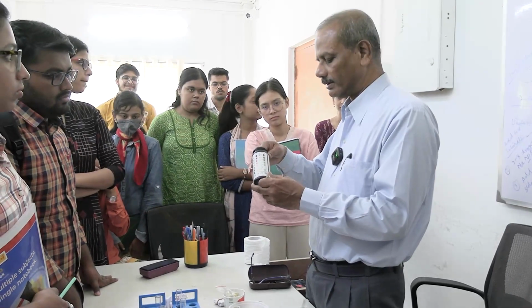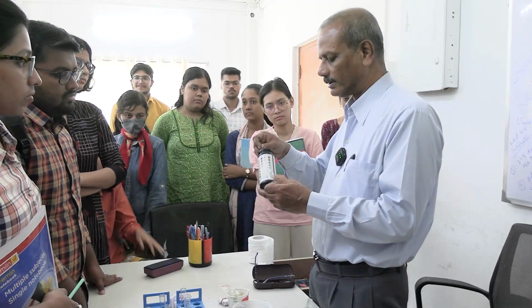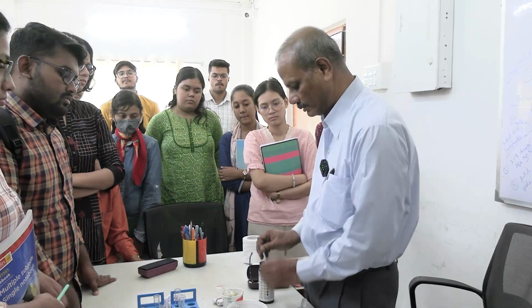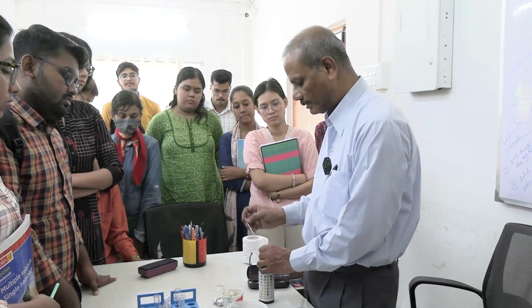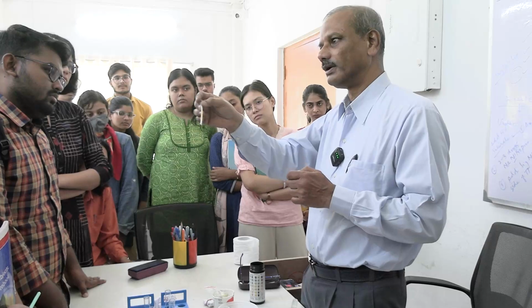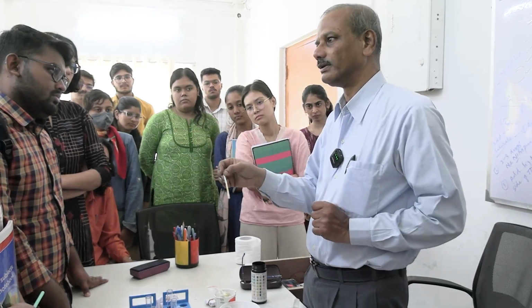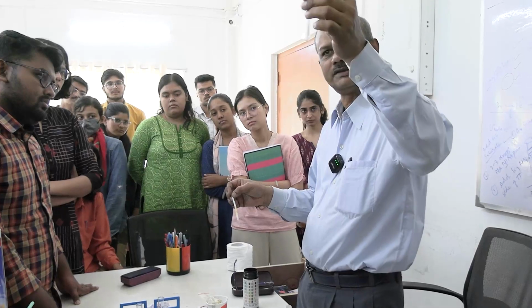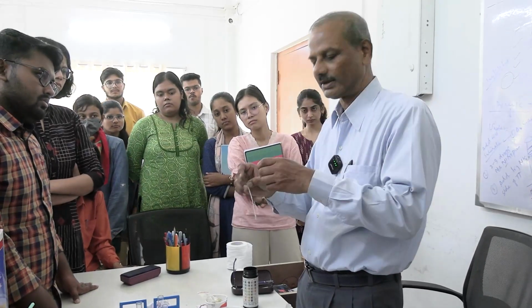So the multi-colored, multi-parameter glucose strip is there. I told you that you can dip it here, or you just ask the patient to pass urine directly on it, so that there is no requirement to use this test tube again. This is a problem of washing, throwing, and so on.